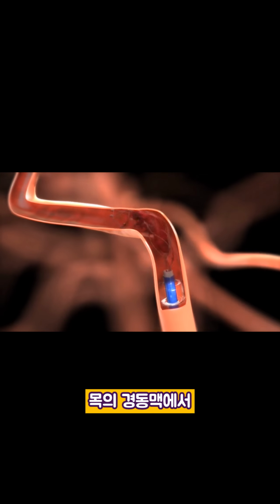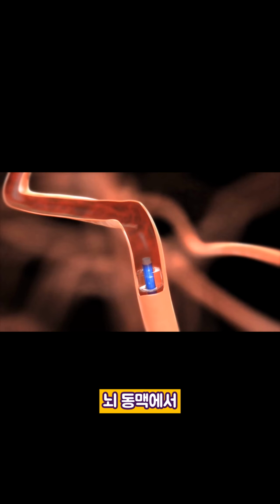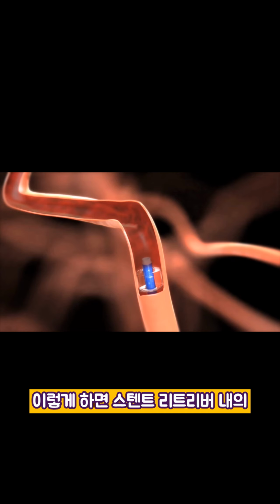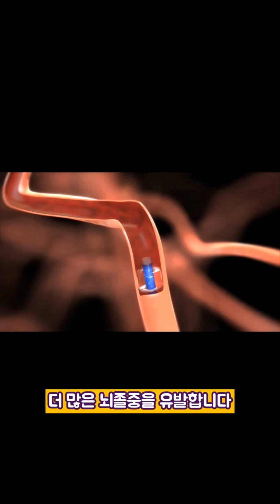The purpose of inflating the balloon in the carotid artery in the neck is to reverse flow from the brain arteries and into the catheter, out of the patient's body. In this way, any particles that break off from the blood clot within the stent retriever will get sucked out of the patient's body. They don't go out distally and cause more strokes.